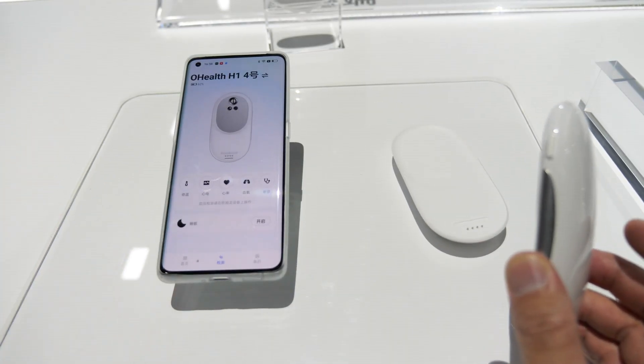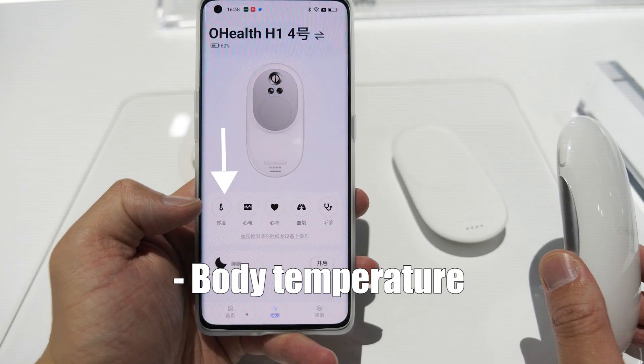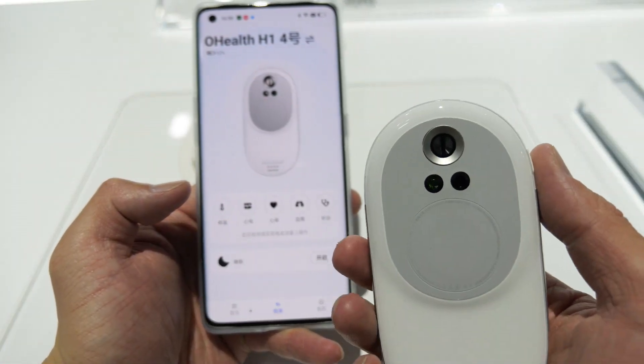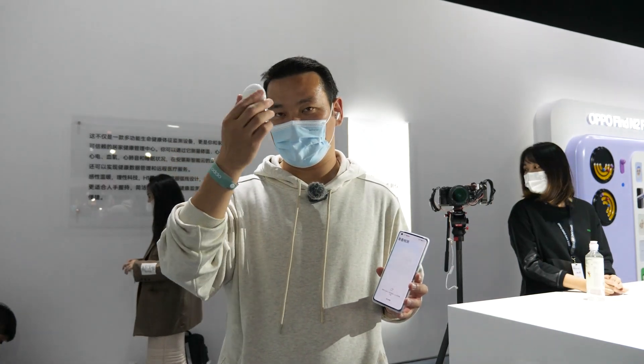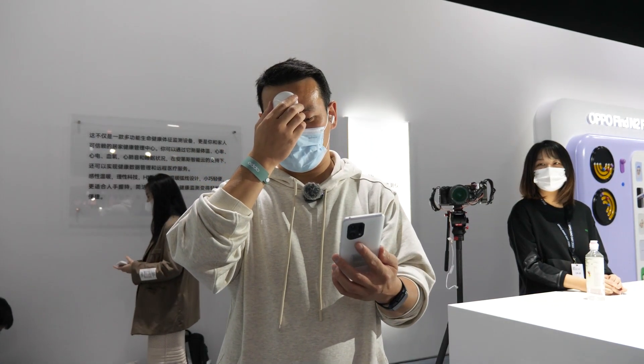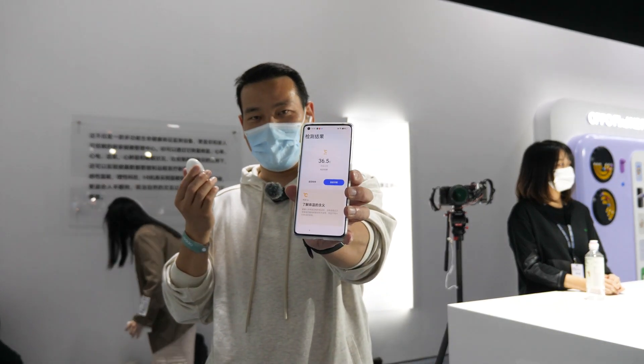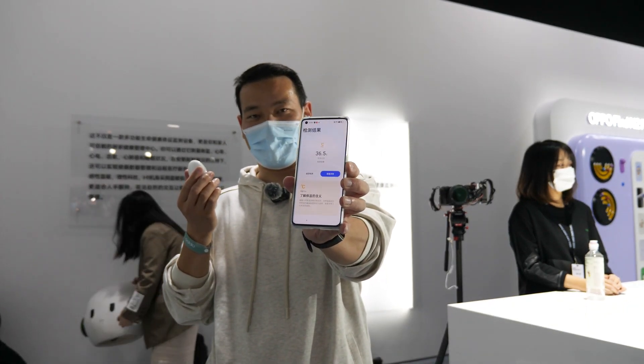So it can do six things. First is temperature — it can measure your temperature. Just hold this for one second, put it to your head, and confirm. So it should be normal, not got COVID or something.